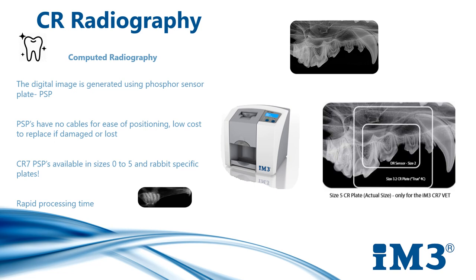IM3 offers the largest range of plate sizes for veterinary dentistry and small animal extremity applications. Our plates are available in sizes 0–5 and they have a rapid processing time of approximately less than 8 seconds for a size 2 plate. The size 5 high resolution image plate is unique to the CR7 processor, and when combined with our positioning kit, it allows full mouth acquisition in medium to large dogs in as little as 6 views. By using our positioning kit and size 5 plate, you are unlikely to miss teeth and therefore won't need to retake images, resulting in less radiation exposure and shorter anaesthetic times.